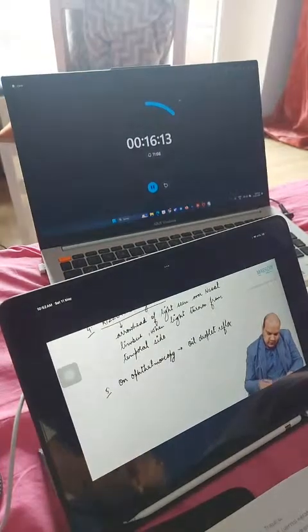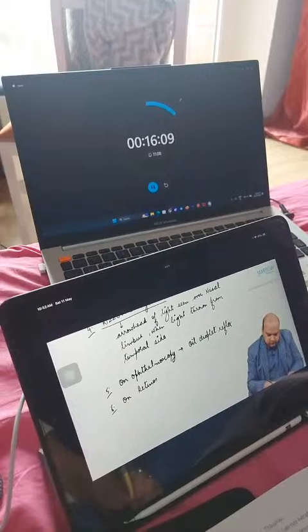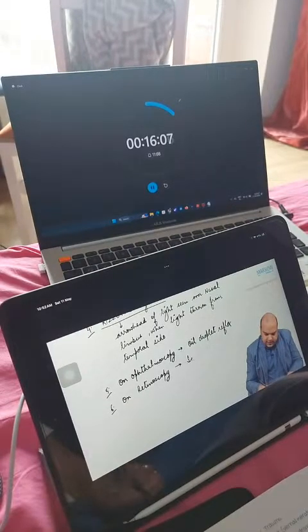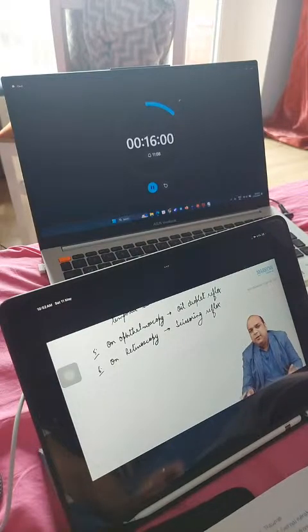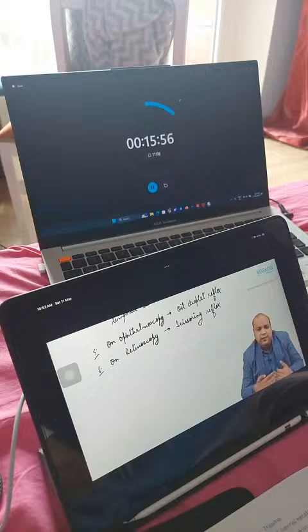Yes? Now, moving on, everybody. Sign number 6 on retinoscopy: something called the scissoring reflex is seen. I know you like to see the photograph of this, but this is not at all identifiable in a photograph. This can only be seen in a video, everybody. I don't personally have a very good video of a scissoring reflex. I have not been able to record it, guys. Please just learn this name.